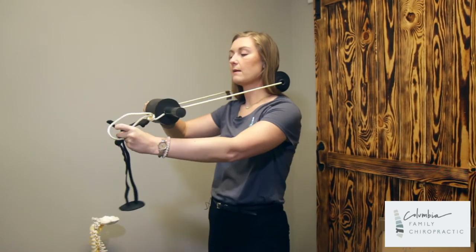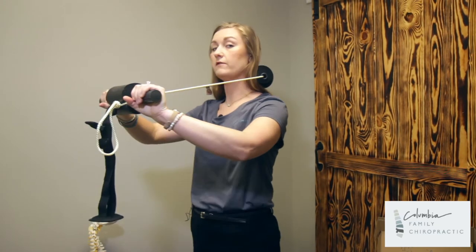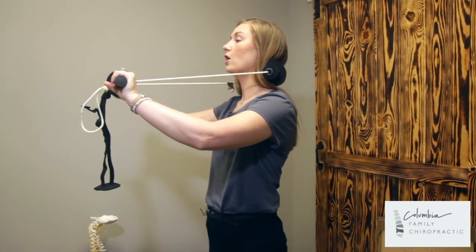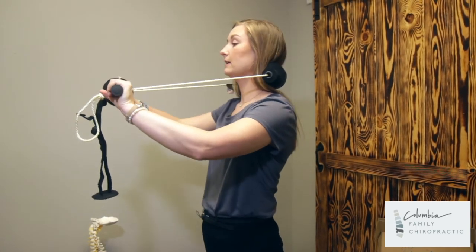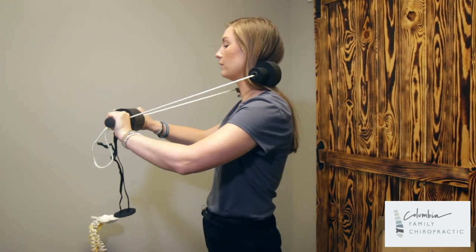Instead of this coming underneath the chin, it will be out in front of you. Now, depending on what your doctor prescribes, there are a few different ways to hold this. Right now I am holding it straight on — that is one option. The second option is 30 degrees down, just like this.